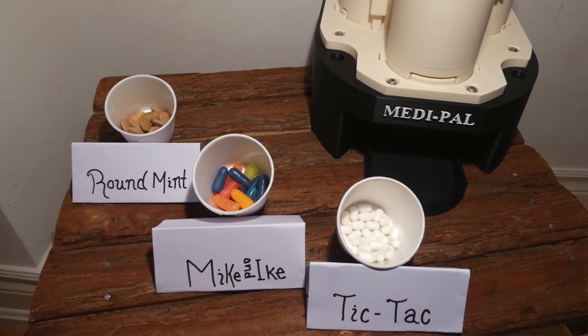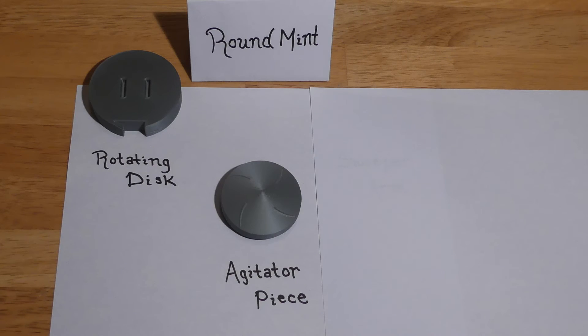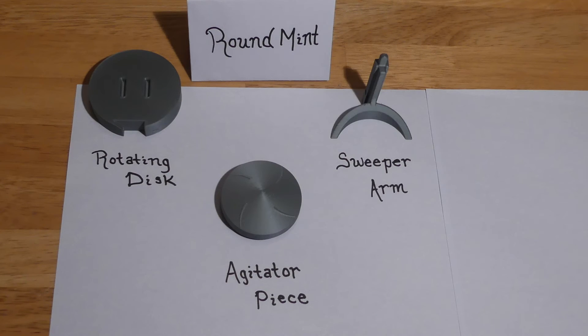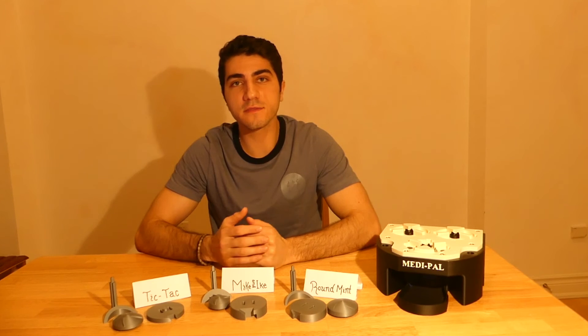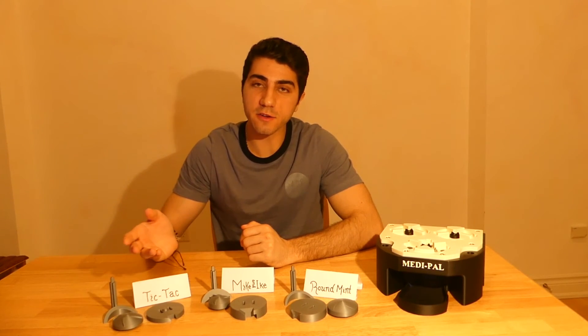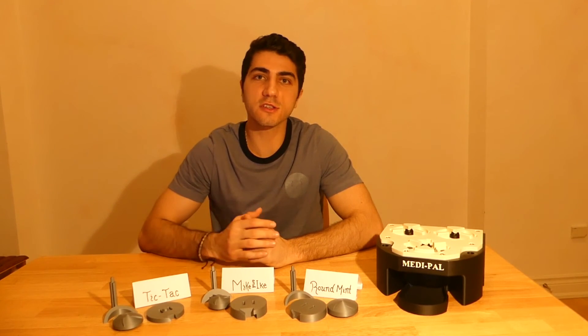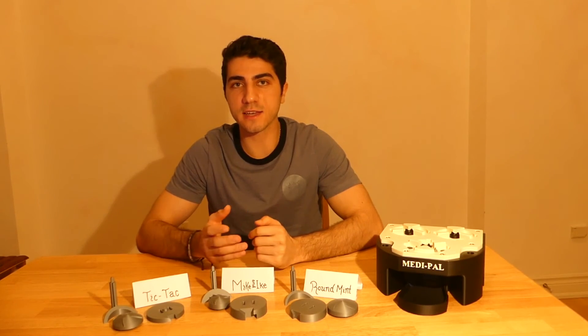These pieces include a rotating disc, an agitator piece, and sweeper arm. A great deal of testing while designing these final pieces ensured that they work perfectly with the three different shapes and sizes of pills.